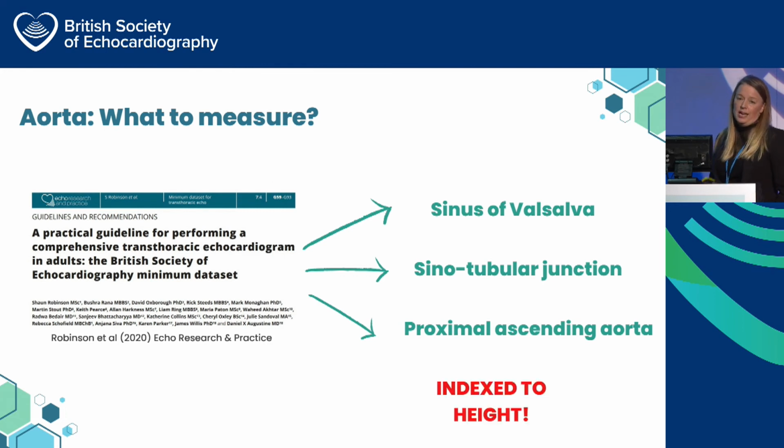Here's the important thing in the latest guidelines. They are not indexed for body surface area, they are indexed for height. Really important in your departments that you check whether your reporting software has been updated to reflect those latest guidelines. None of us have got time to be indexing things manually when we're reporting, have we? So make sure that your department guidelines are modified for that.